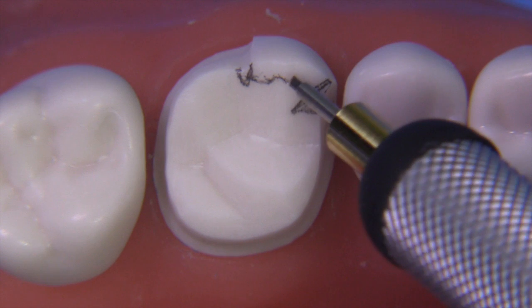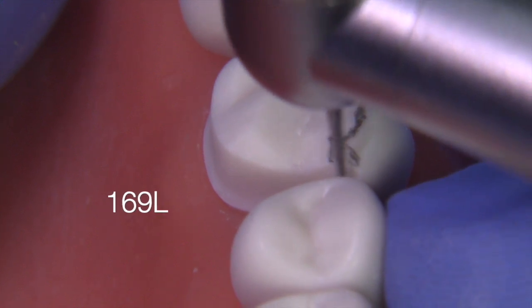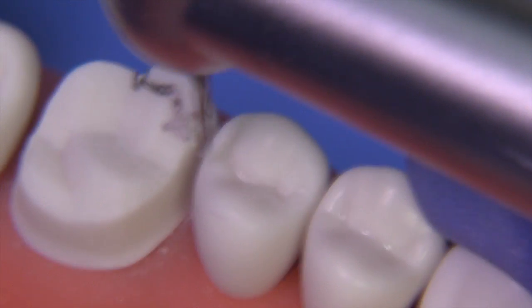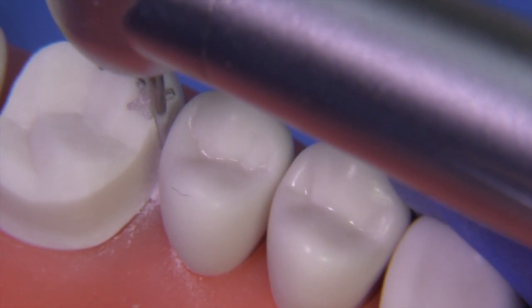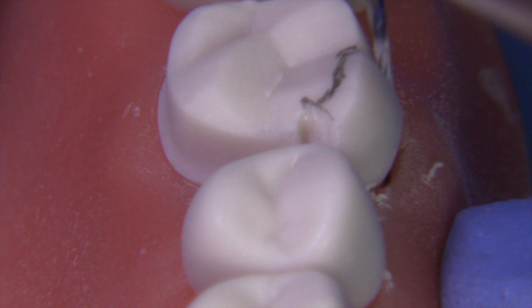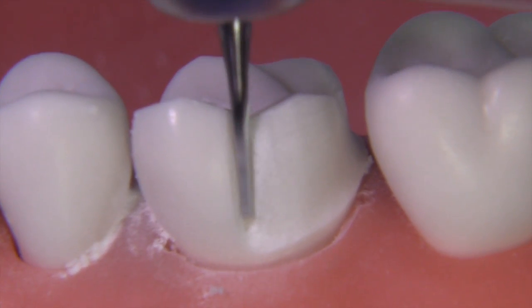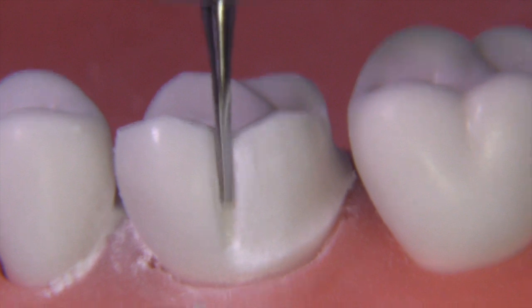Then we're going to make another triangle of success on the facial, which will allow us to line up these two grooves together with an offset. Using the 169L, starting at the top and working more gingivally in a stair-stepping technique — not trying to do it all at once — lining up the burr along the long axis of the line of draw of the preparation, then working it down toward the finish line, making sure we stop short of the finish line by approximately 0.5mm. We then hold the handpiece in the groove on the mesial and transition onto the facial to create the facial groove, which provides bulk, durability of the finish line, and additional retention and resistance form.